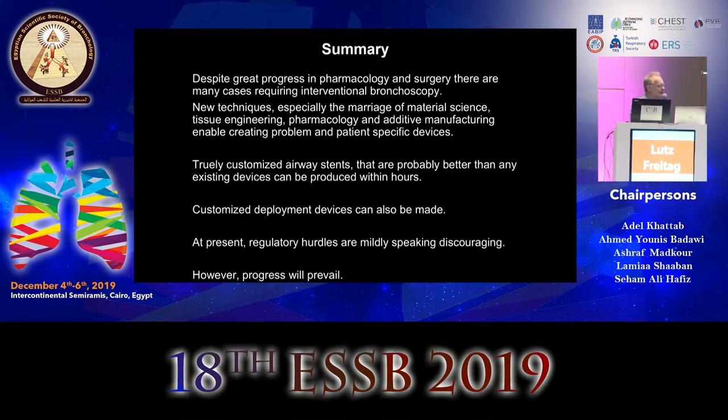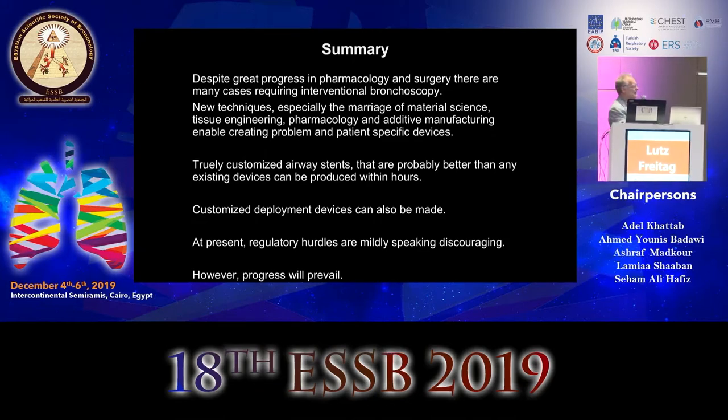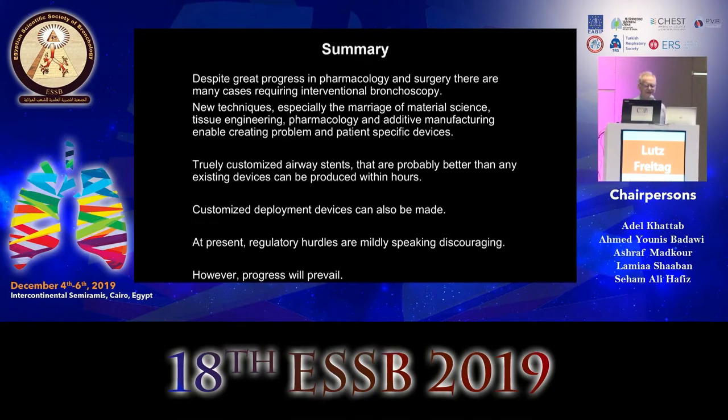So the summary: despite great progress, we have problems which can only be solved for interventional bronchology. New techniques, the marriage of material science, tissue engineering, pharmacology, and additive manufacturing enable creating problem- and patient-specific devices. Truly customized stents are probably better than anything that we have. Customized deployment devices can also be made. At present, regulatory hurdles are, mildly speaking, discouraging. However, progress will prevail. Thank you very much for your attention.